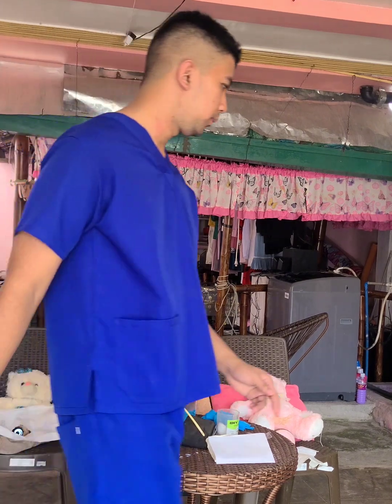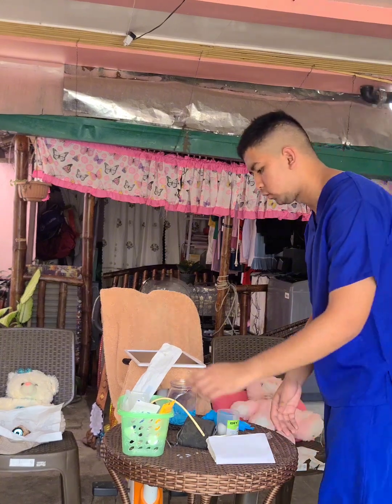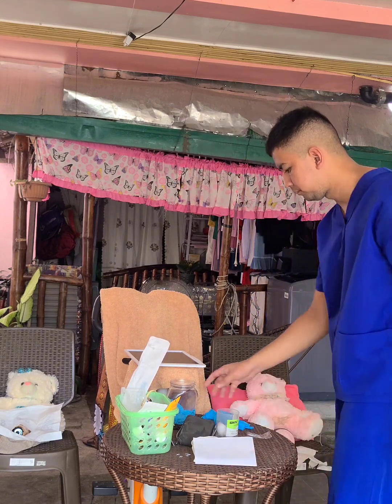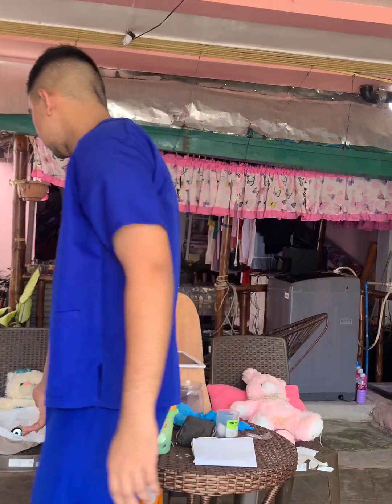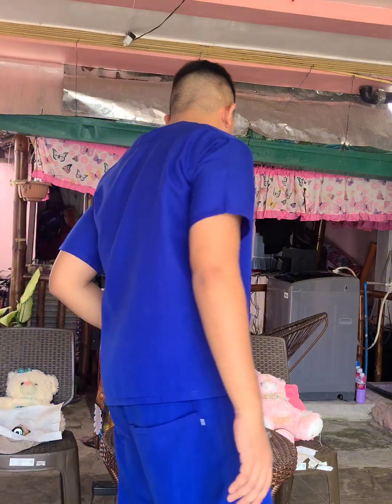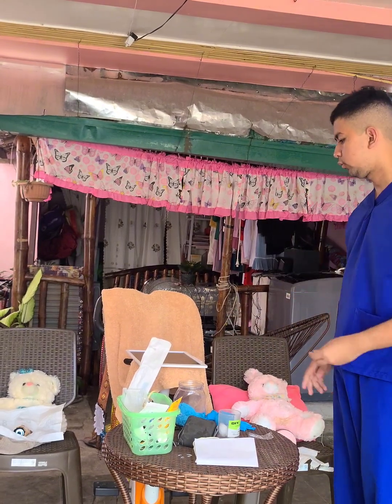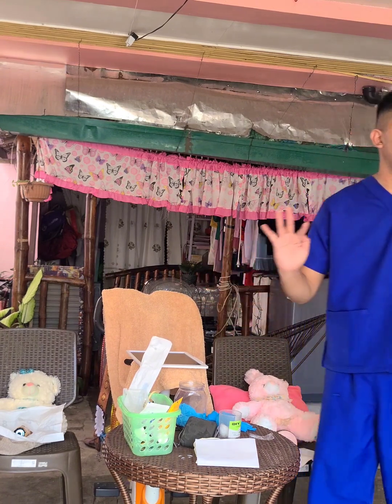So now with that all being said, we're going to gather all the important equipment. So we have the sterile catheter, which is still sterile. We have the sterile gloves, the clean gloves, the drainage, the drape, the lubricant, and then the alcohol for proper hygiene performance. Then after that, we have the important equipment.